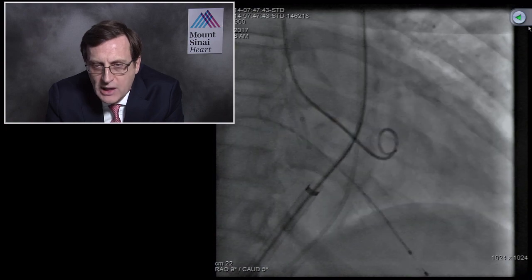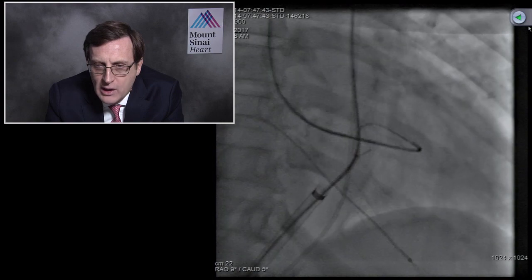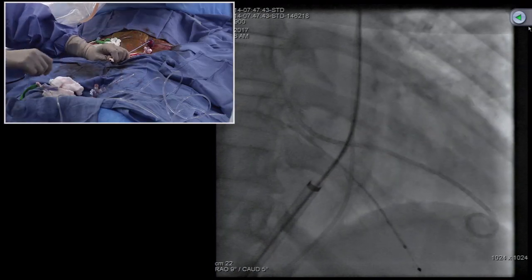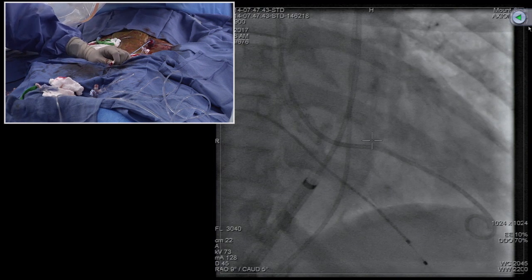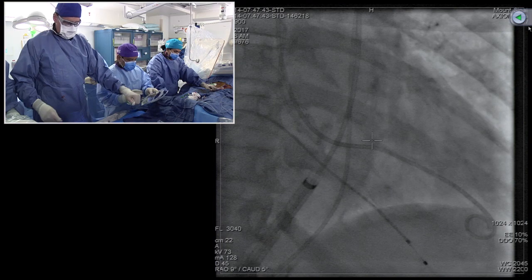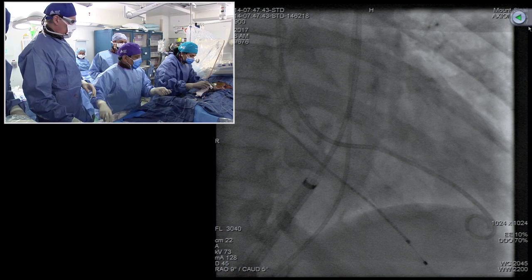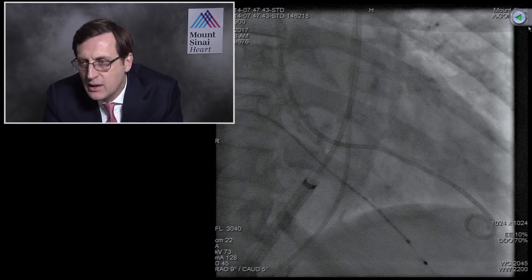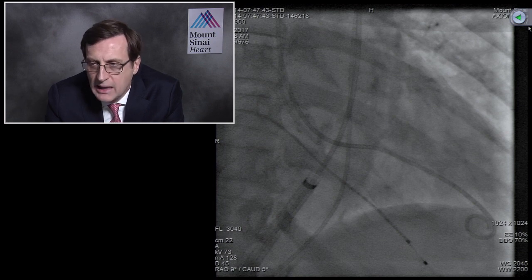for obvious contraindications, and then again we screen with an aortogram during the case and exclude those where we feel that there's excess calcium at the takeoff of the innominate and the carotids, and only the takeoff is at issue. That's another important point. A lot of people are asking and telling us regarding an 80% bifurcation carotid stenosis or an occlusion of the carotid or something like that, where those have nothing to do with it.